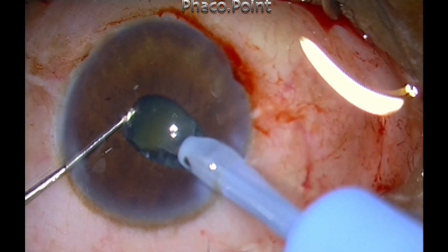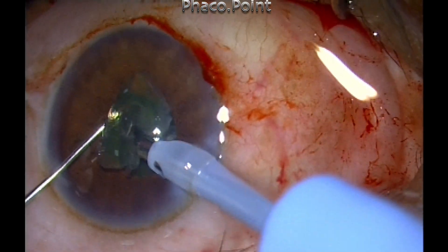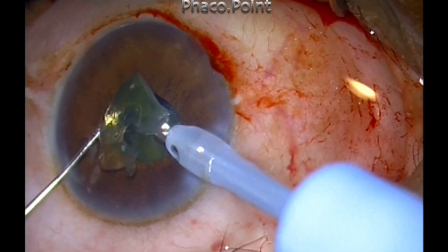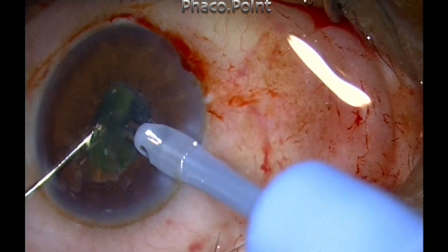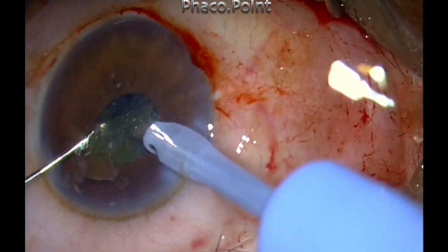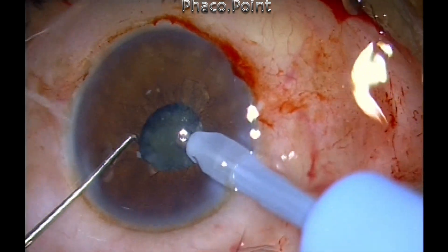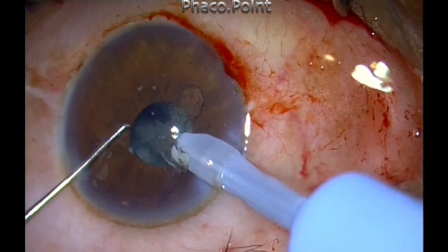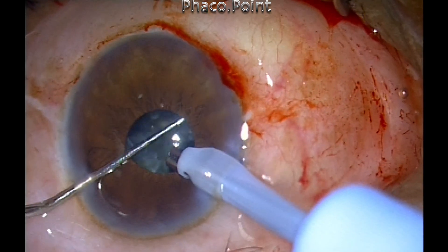Once the piece is held and brought into the pupillary zone, you can use the nucleus fragment as a strut astride the pupillary plane in order to keep the pupil from going down further. Then, staying only within the central area of two to three millimeters within the pupil — imagining a concentric ring in your head bang in the center of the pupil — that's where the phaco probe needs to be.